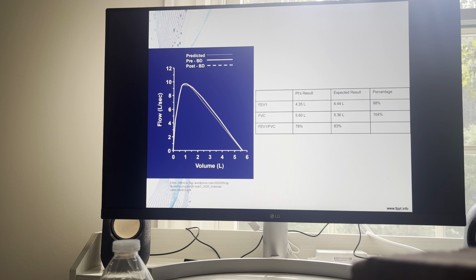Option number 2, do an exercise challenge. Now, in most cases, that's referred out to pulmonary, but you could certainly do it in your office. The patient exercises for 15 minutes, get them on a treadmill, crank that thing up, and then have him do spirometry. Now, obviously, you would want a rescue medication on hand should you have an asthma attack in your office. Or number 3, get him in for a methacholine challenge test. So you have some options there.